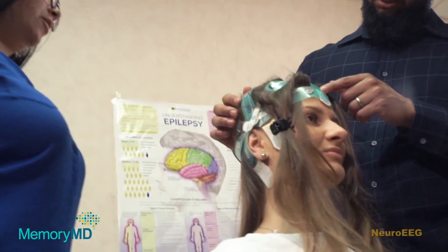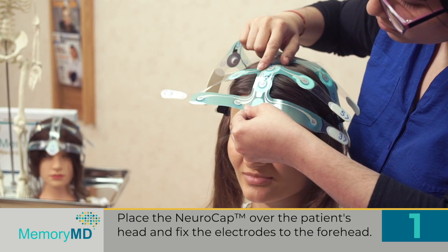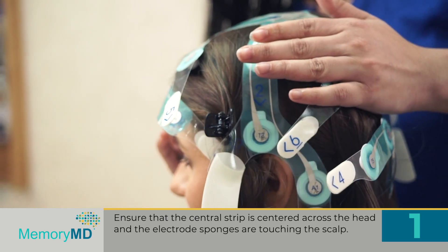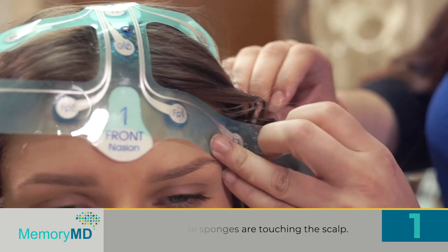The test is done in six easy steps. Step 1: Place the NeuroCap over the patient's head and fix the electrodes to the forehead. Ensure that the central strip is centered across the head and the electrode sponges are touching the scalp.